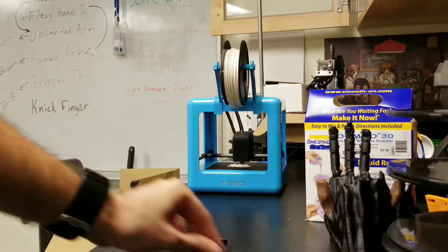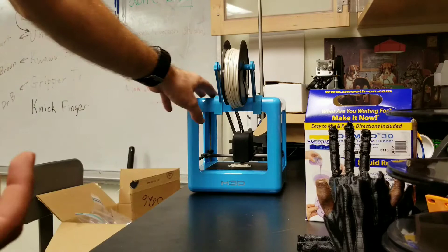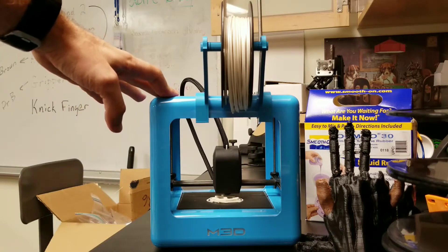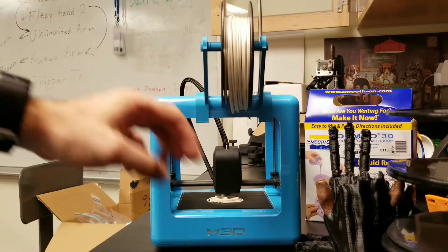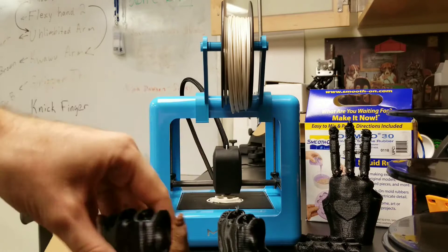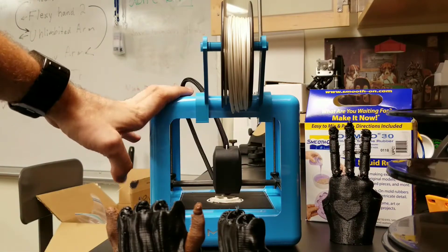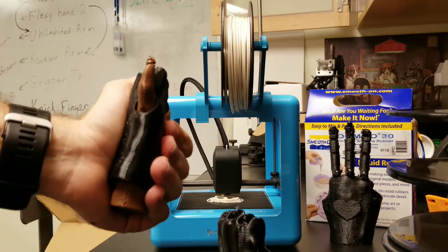Anybody out there can do this pretty easily and reliably using this printer right here — the Micro M3D printer. You can buy this now online for about $200. All of these things you see before you — the gauntlet, the 3D scan of the hand, and all the fingers — were all printed on this Micro 3D printer using their Tuffink, which is their iteration of NinjaFlex. So it has nice flexibility, which you can see in the finger joints.